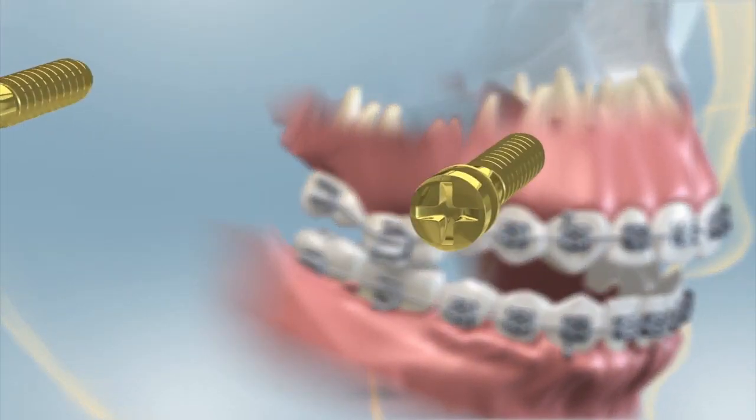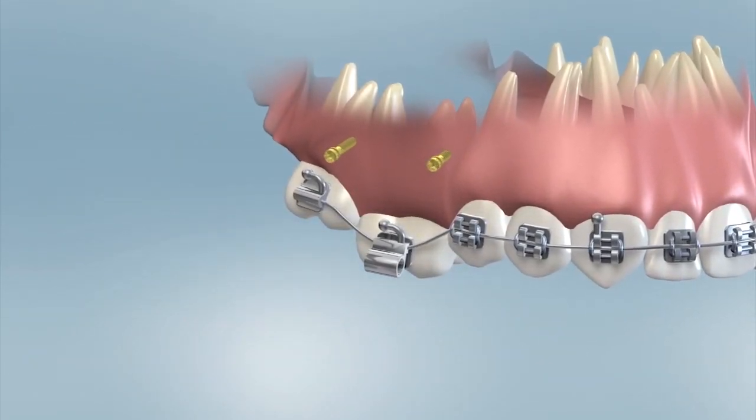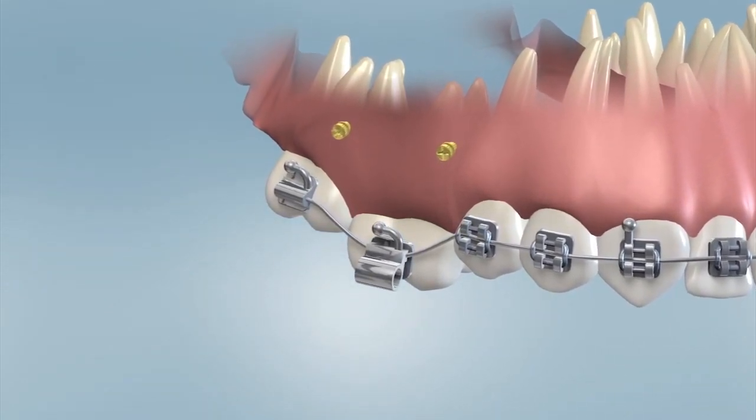A TAD is an acronym that stands for Temporary Anchorage Device. These are little metal pieces that, after they're placed, look similar to an earring stud. They are temporary miniature surgical screws that are placed through the gums and into the jawbone. This is a relatively minor procedure. Once placed, they become anchored in position and usually will not move until physically removed by the doctor.